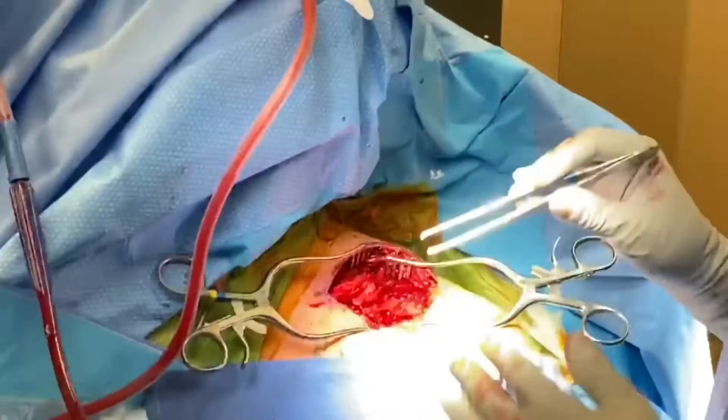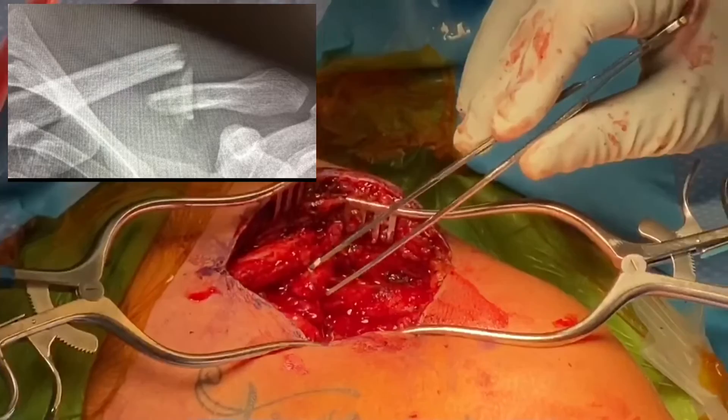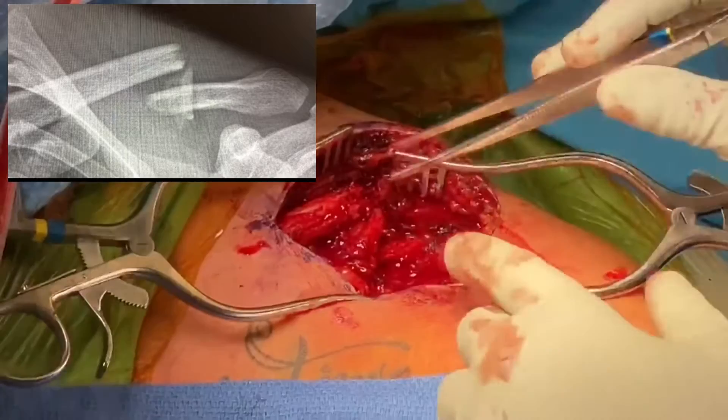Hey guys, we've exposed that clavicle fracture, so let's look at those and then we can correlate it with the x-ray. This is the most medial aspect of the shaft here — this is the part that sticks up under the skin that patients feel. This is that floating butterfly piece, we call it a butterfly piece, and then here's the lateral aspect of the clavicle.